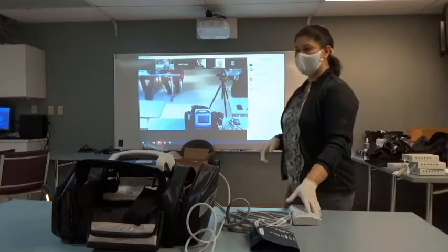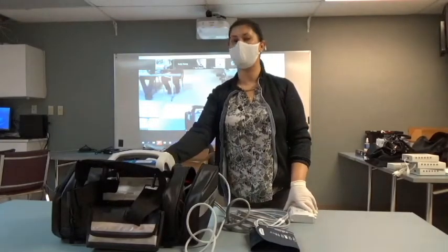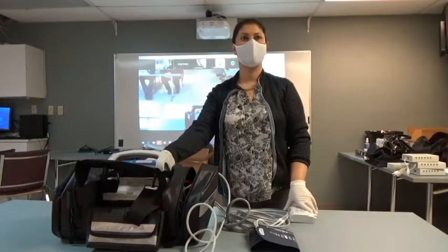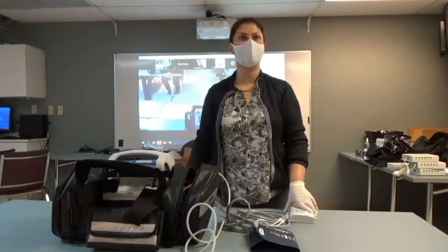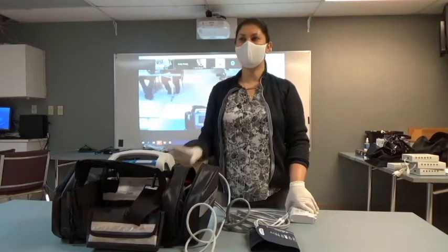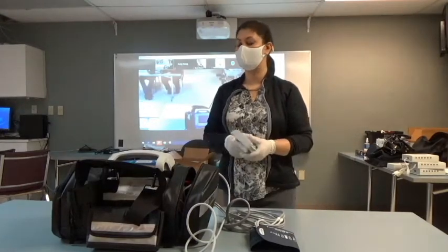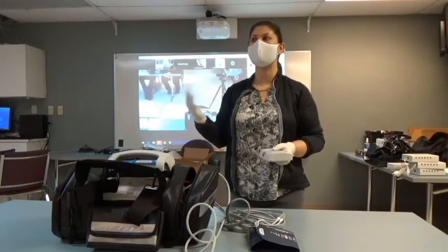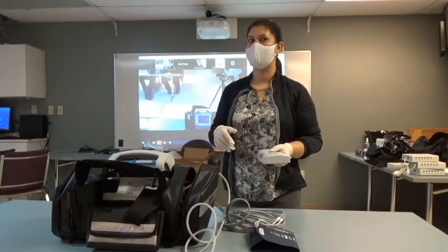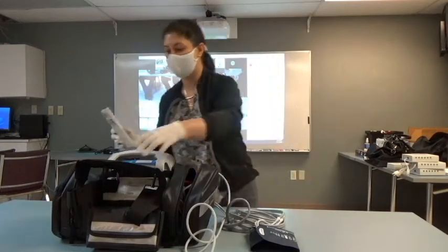Do you guys all see the Ghostbusters or no smoking symbol up at the corner there? This is your ready for use indicator. It's up at the top on the right-hand side. If you happen to see this when the device is on, running off of the battery source, you're going to get a message in the center of your screen. You'll want to pay attention to that and take it out of service. Any questions? Okay, let's go ahead and put the batteries in.